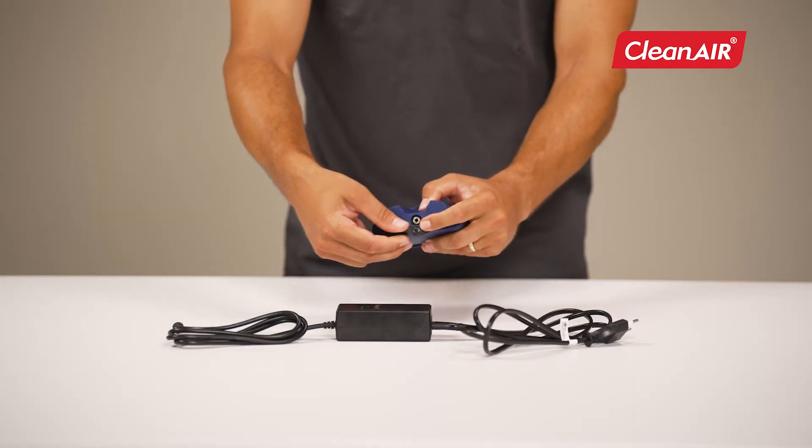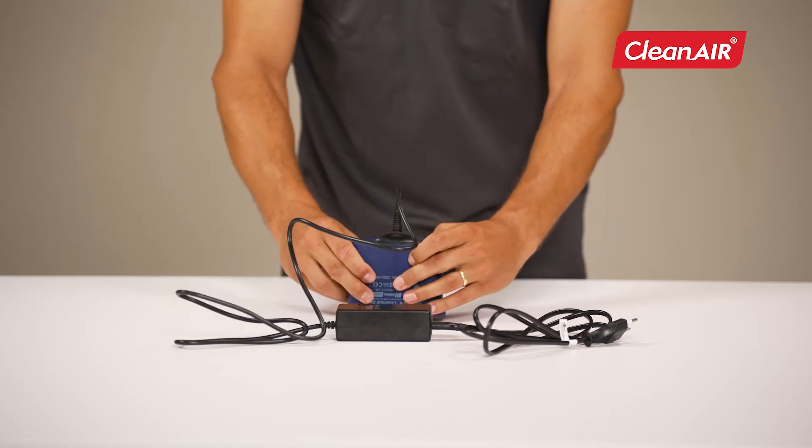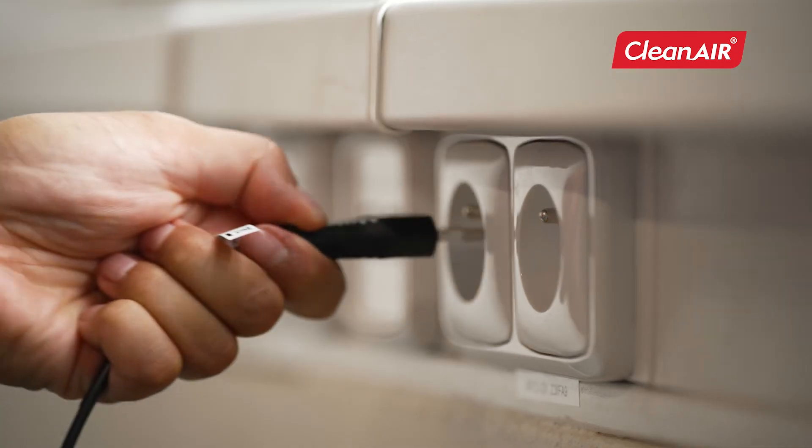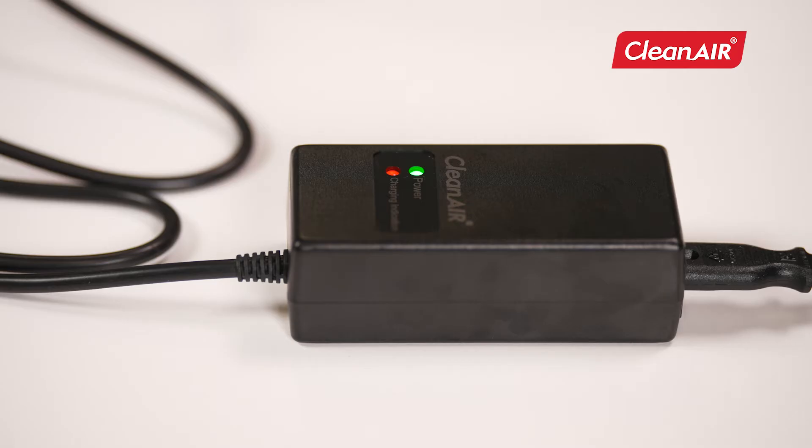To charge, plug the connector into the battery and insert the charger into the socket. The charging is complete when the red light goes out.